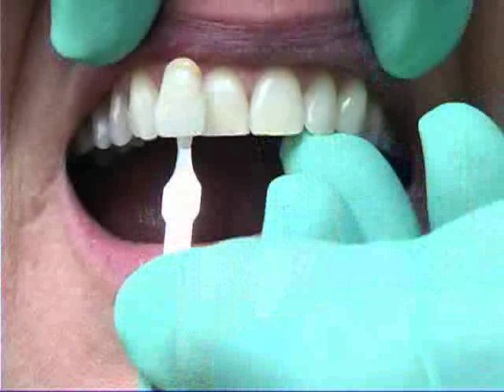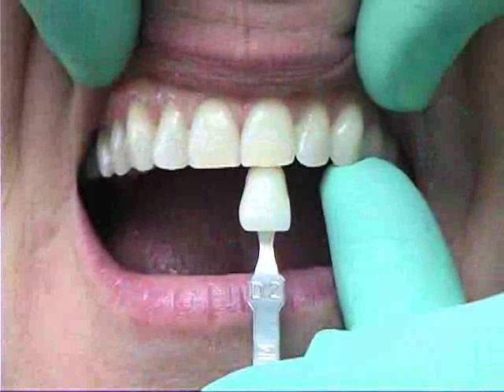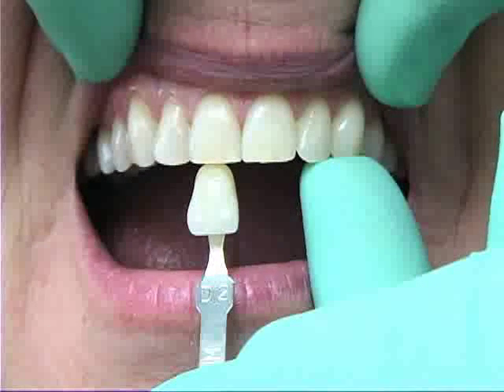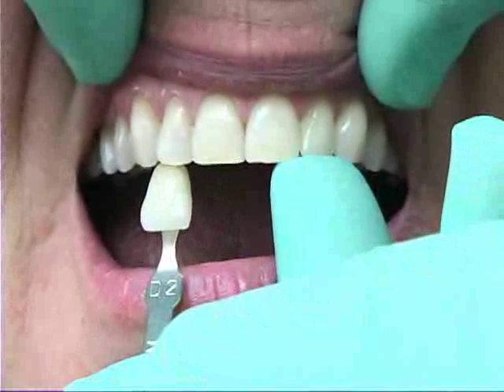When a shade guide specimen is superimposed over a natural tooth, the color may appear different because a tooth-colored background is present instead of the darkness of the mouth that serves as the background for natural teeth. Moving the specimen from side to side so it is located beneath different teeth can also be helpful. When the final selection is made, it is recorded in the patient record and on the laboratory work authorization form.